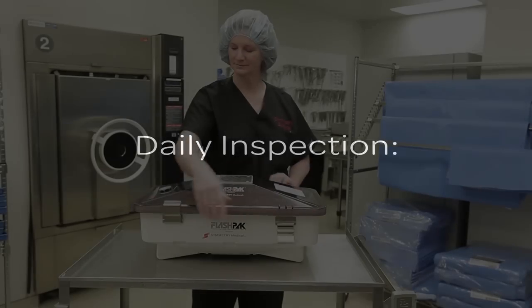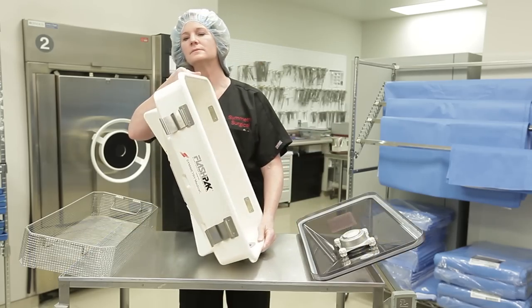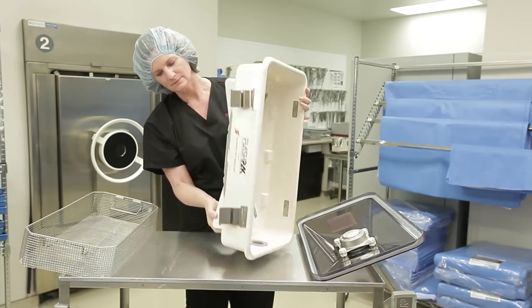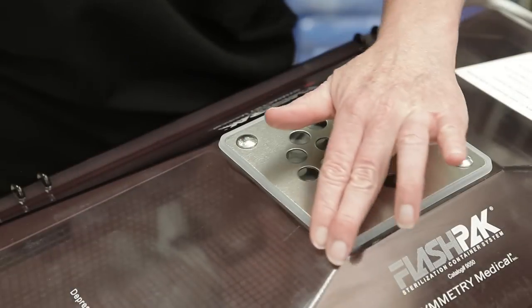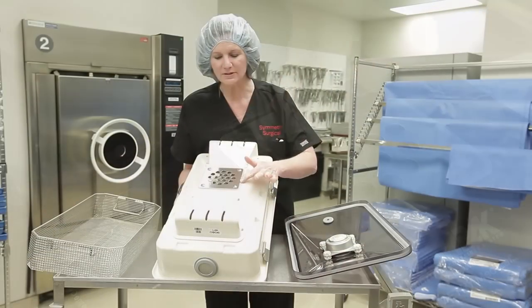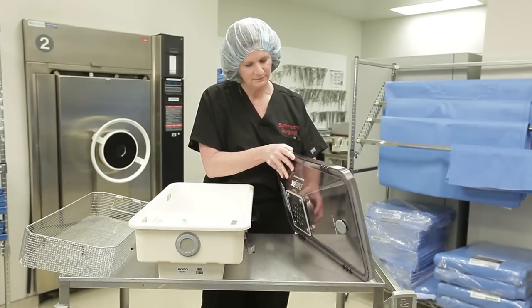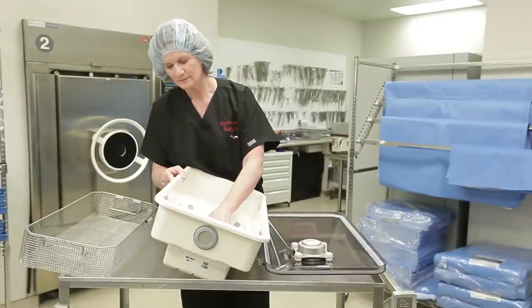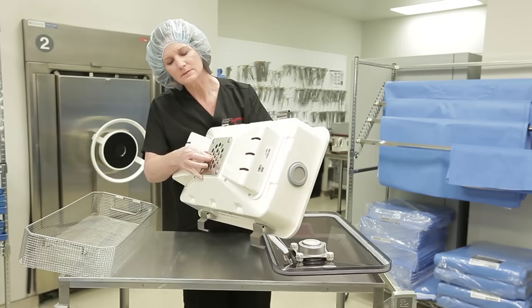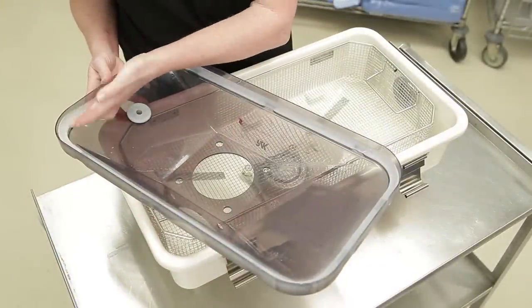Daily inspection: visually inspect the entire container looking for chips or cracks. Check the silicone lid gasket, valve seals in the lid, base, and the vent to ensure there are no cuts, tears, or other damage. Verify that the valve plate fully engages the silicone valve and seals around the circumference of both the lid and base valve assemblies. Do not use a FlashPak that is chipped, cracked, or that has damage to the lid gaskets or valve seals, or is otherwise visibly damaged.